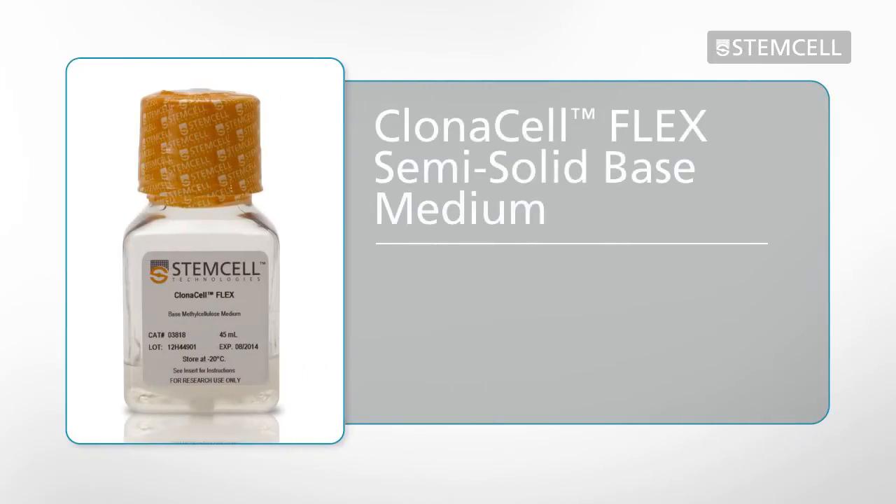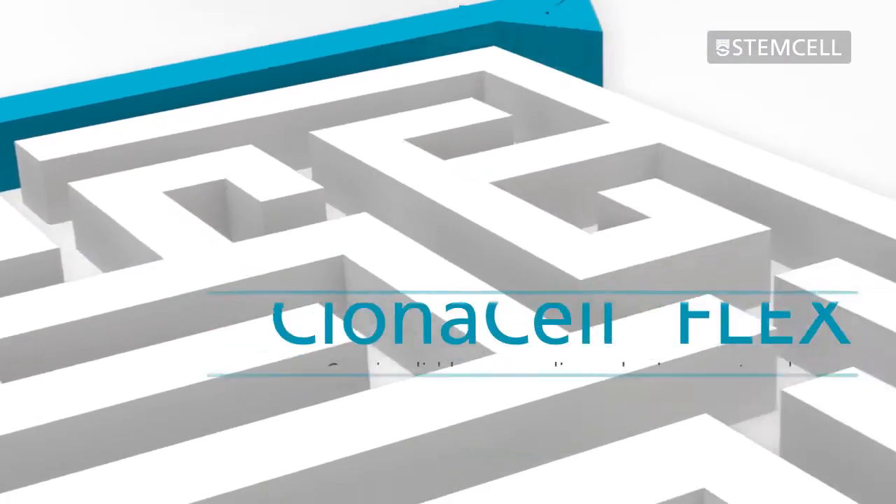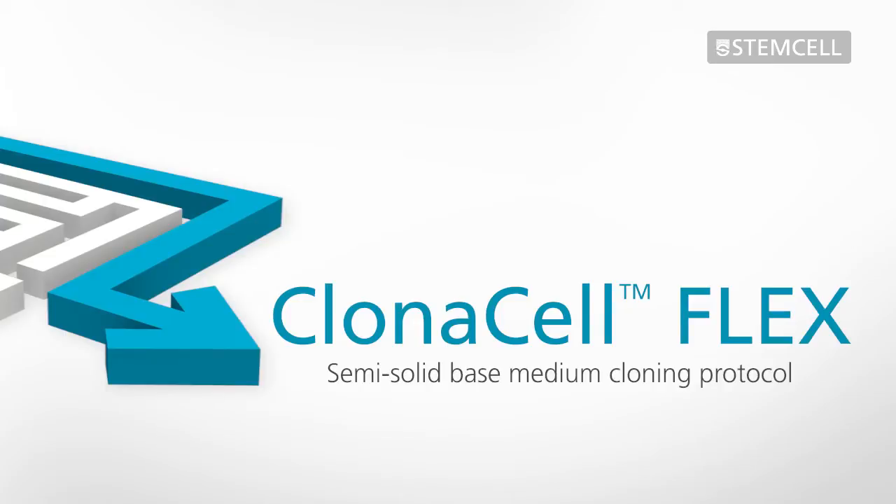ClonaCell Flex Semi-Solid Base Medium is designed for cloning a wide variety of cell types. By adding a 2x concentrate of your own liquid cell culture media, you can create a semi-solid cloning medium customized to your own cells and processes. This video describes the semi-solid cloning protocol using ClonaCell Flex Semi-Solid Base Medium.